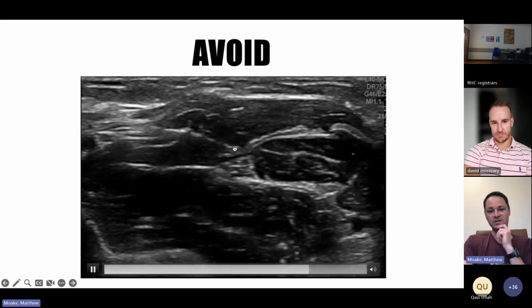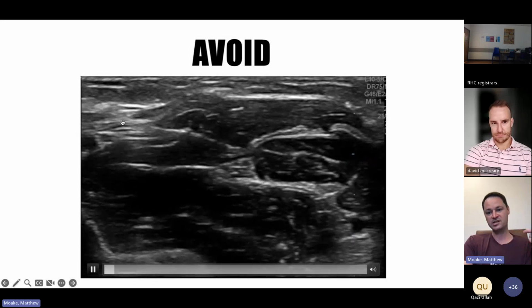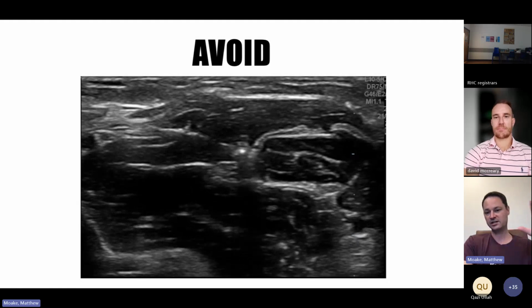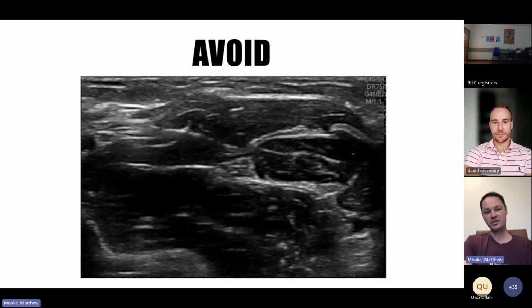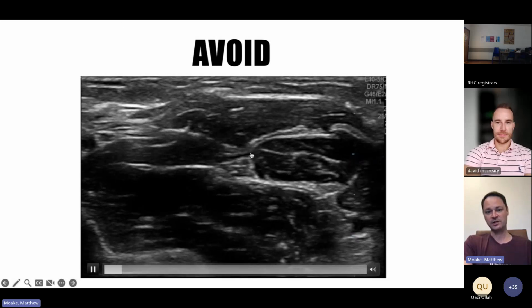One of the things you can do to avoid this air is just once you find your needle in the tissue sort of further away, you can do a quick little test injection to kind of clear your line. And ideally, you should have already cleared the line, but even when you do it before you inject, if you kind of clear it in the space around you, you still could get a little bit of air in there. So I will typically clear it before I put the needle in and then do a quick injection somewhere over here so that I'm not worried about putting air in when I get to it.